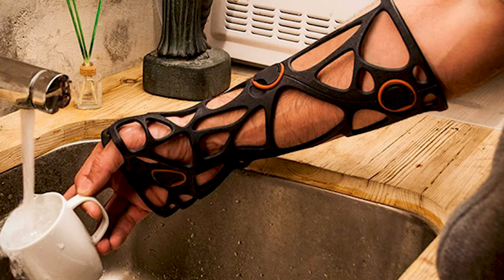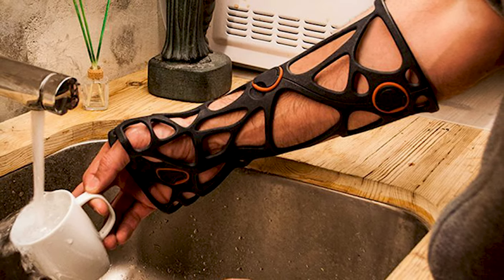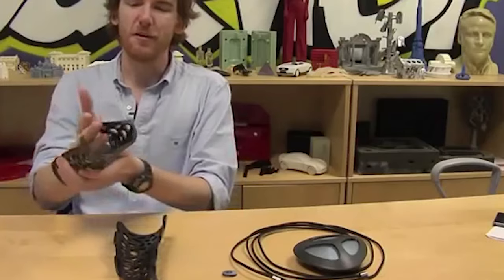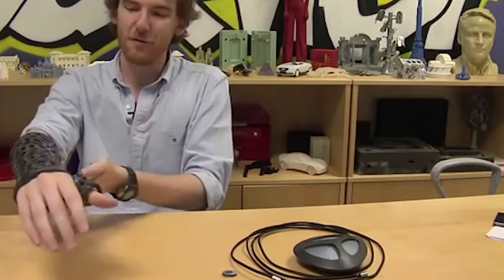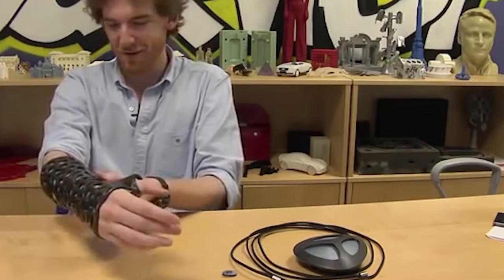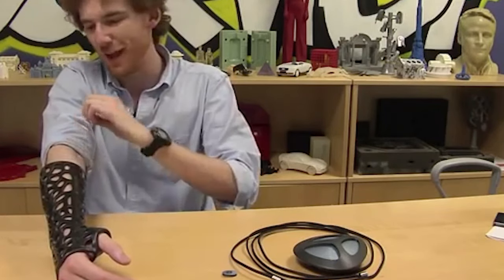3D printed casts solve all these problems. The casts or orthoses are made in the form of a lattice that comprises open sections with plastic posts. As a result, the casts have the required structure but do not completely cover the hand. This way, patients experience more comfort as they don't have to deal with unbearable heat, sweating, or pressure.